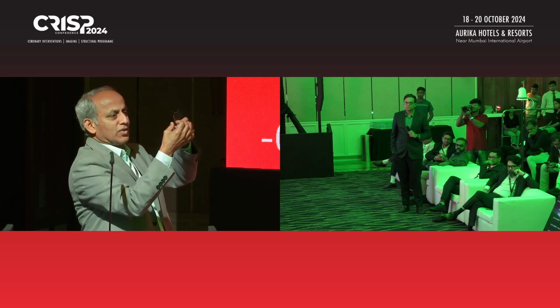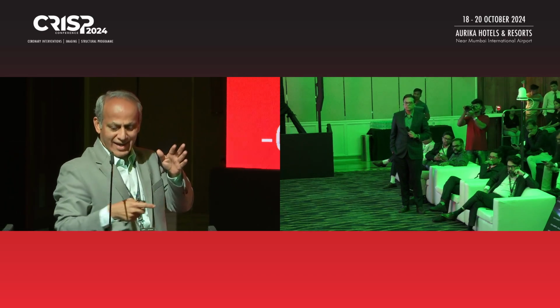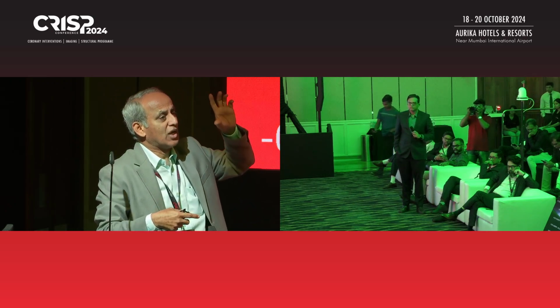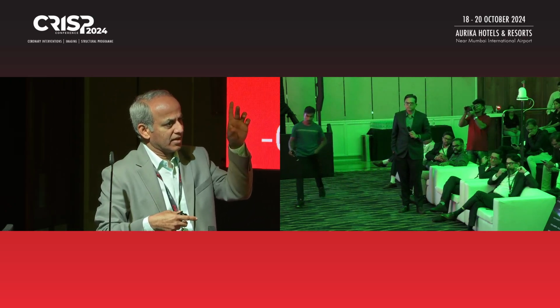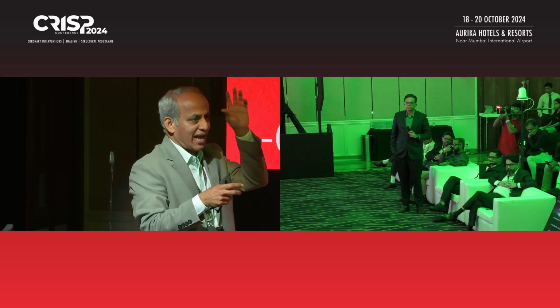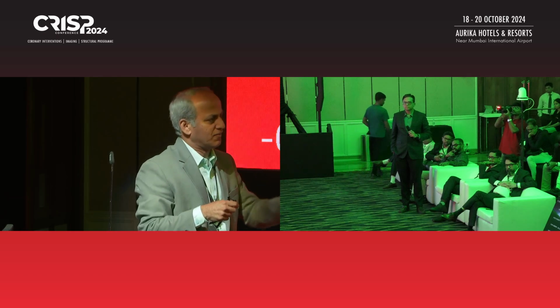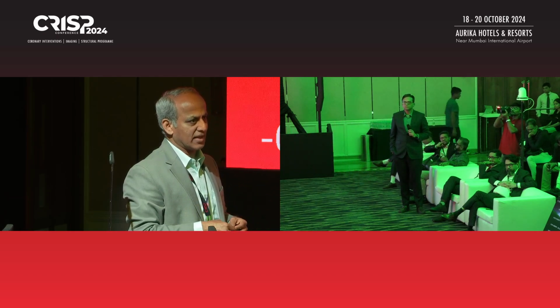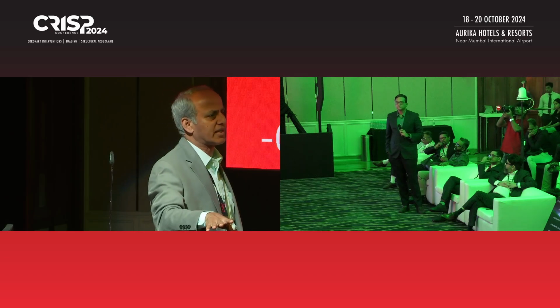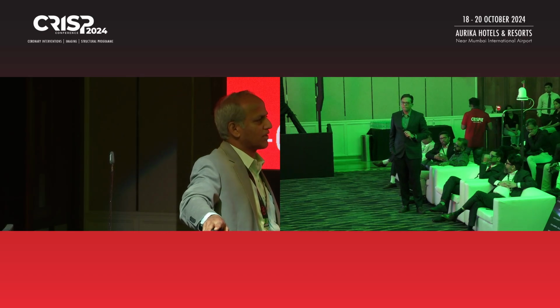You think you are sizing in one dimension for the aortic end. We have had cases, and I have pictures of those, though I did not put them in on account of time, where the device has actually tilted partially past the aortic end. Yet at the entry point, leaving a little bit of the aneurysm, we have been able to close. So I believe strongly that you should close it at the aortic end only, and that too for all aortocameral fistulas, whatever they be.